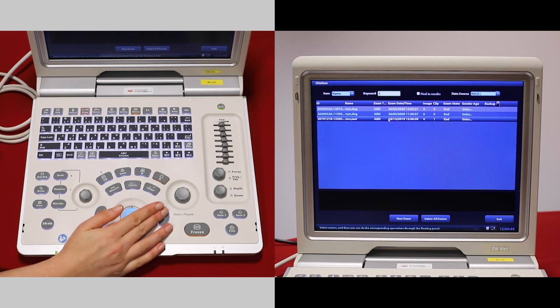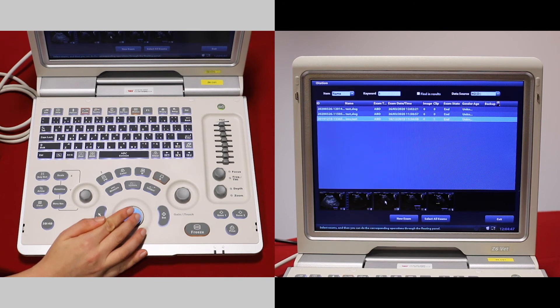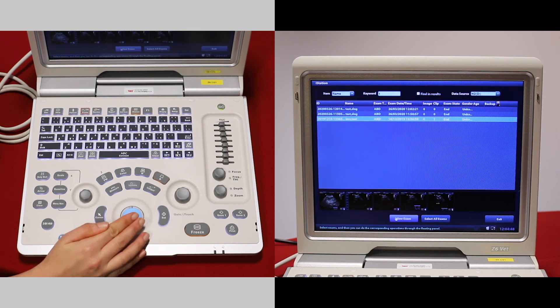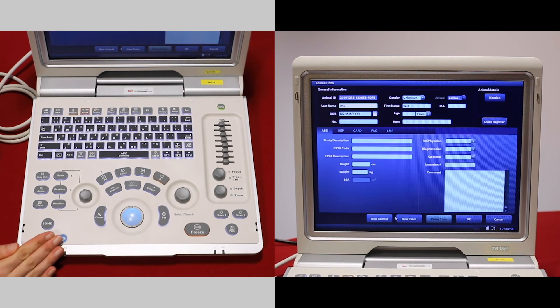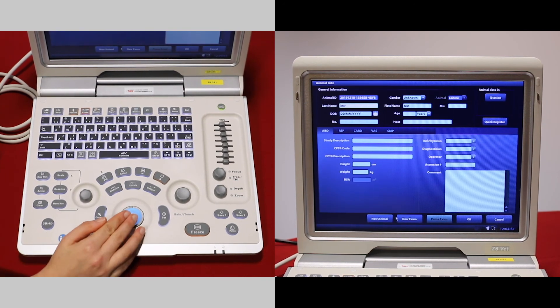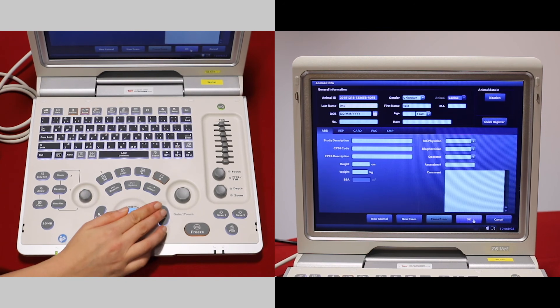If this is the patient, select it and then we can go to new exam. Make sure the details are correct and press OK.